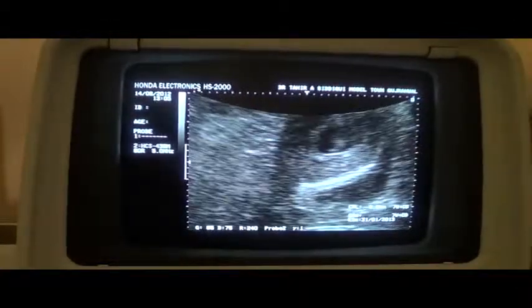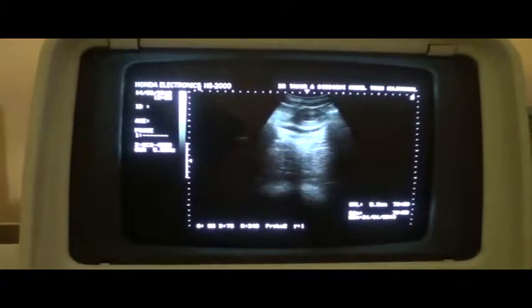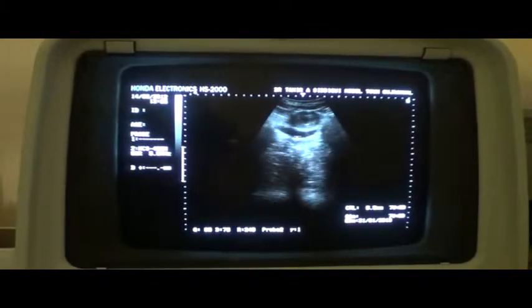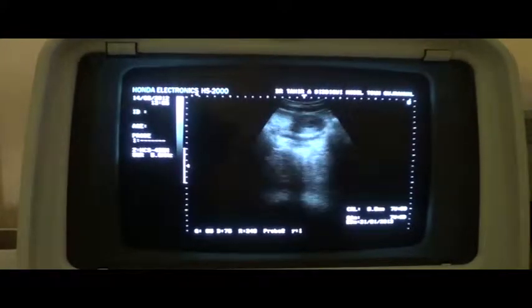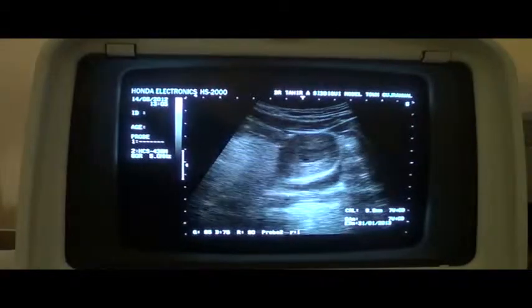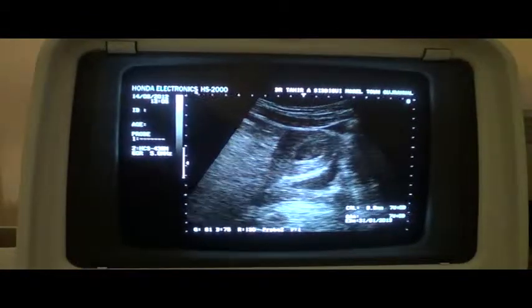Now, this is a new scan. The patient has urinated and the bladder is almost empty. This is the urinary bladder. This is the gestational sac. This is the uterus. I am going to magnify to get a clear view of the gestational sac.